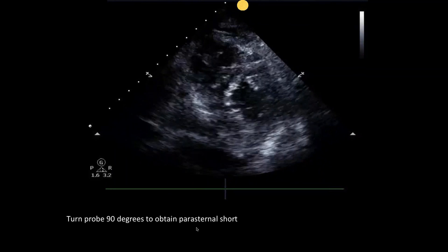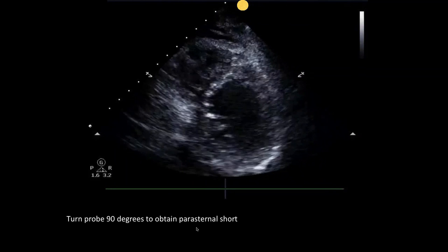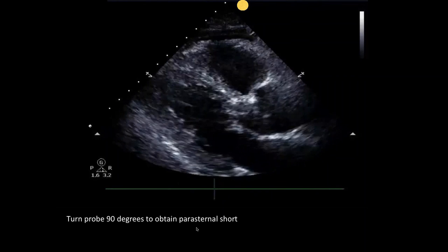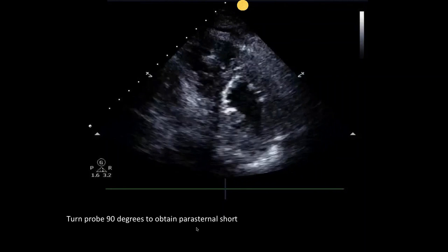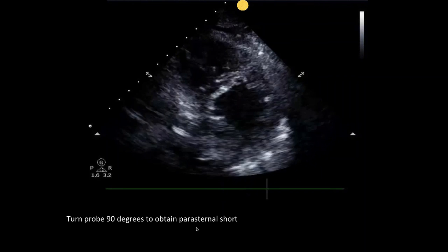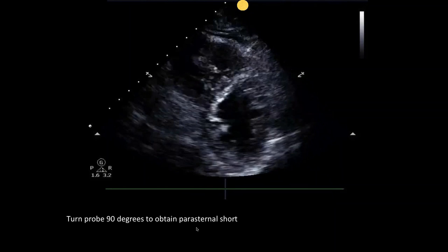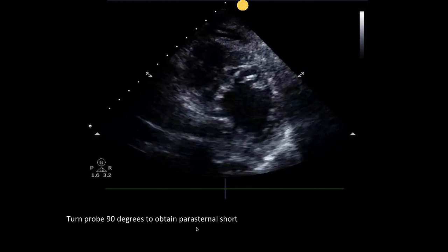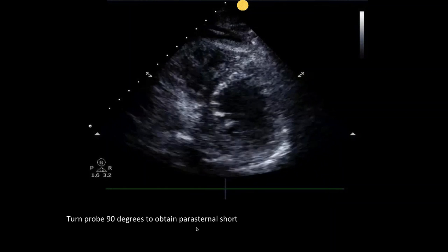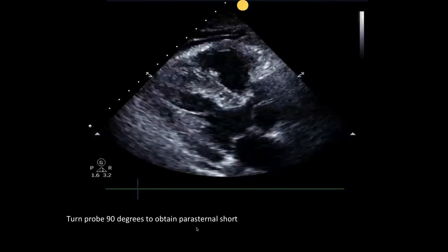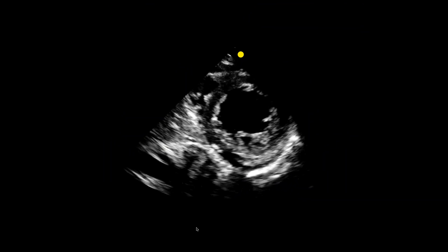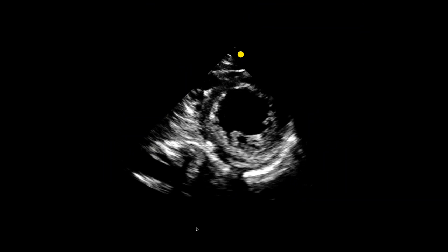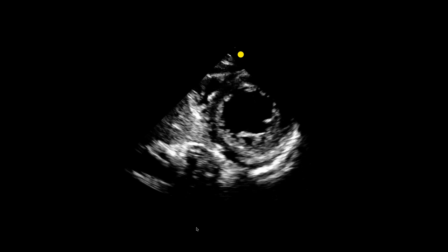From parasternal long, if you turn your hand 90 degrees, you get to the parasternal short view. This gives a nice sense of wall motion — anterior, lateral, or septal wall motion abnormalities. The heart squeezes concentrically, so if you stick your finger in the center of that ventricle, it would squeeze around your finger in normal contractility. Moving toward the left hip from there gets you to apical four. Here's a parasternal long of a patient with poor contractility — the ventricle is barely squeezing and the EF is likely very poor.